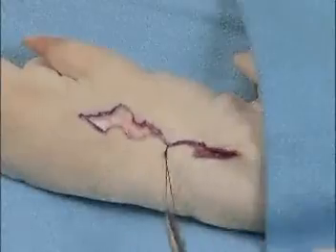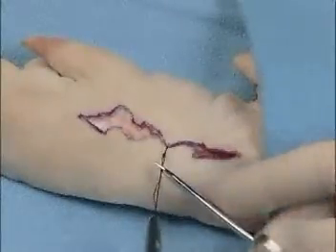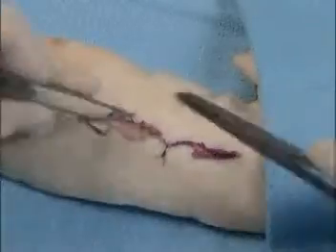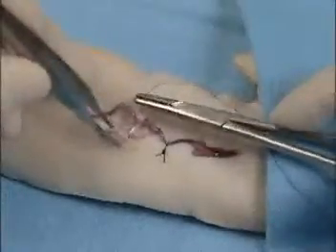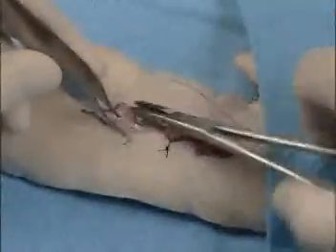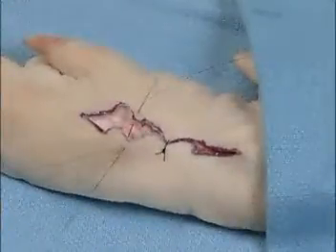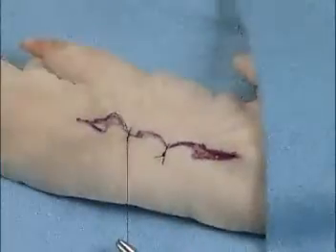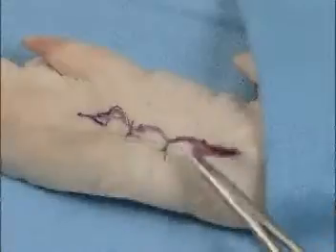Now you can see how nicely, with just one suture placed, the wound is coming together. And that is because of the wide undermining. Again, the sutures are placed peak to valley, apex of the peak to the depth of the valley, and you can see how nicely this begins to close this pig's foot. The remainder of the sutures are placed peaks to valleys, and then according to the principles of halving.